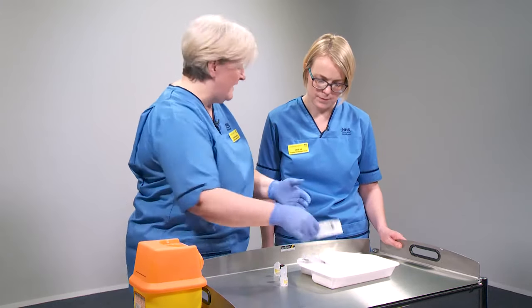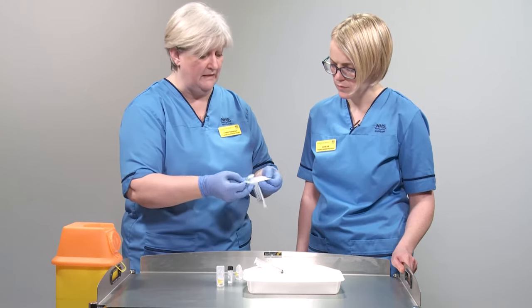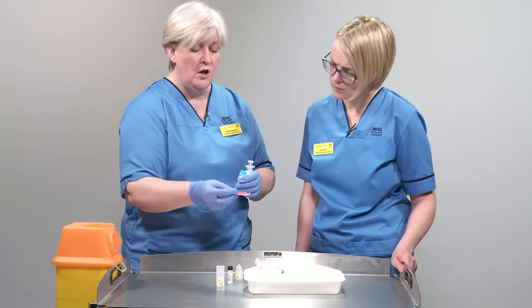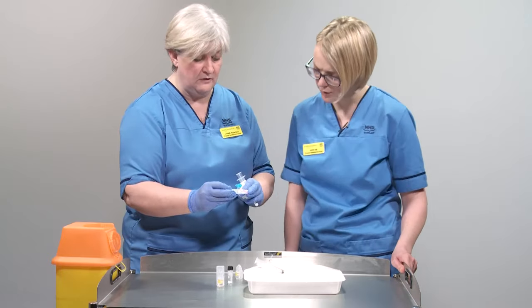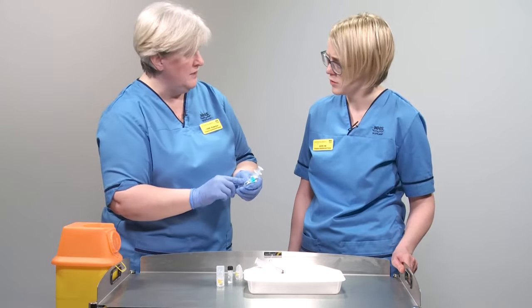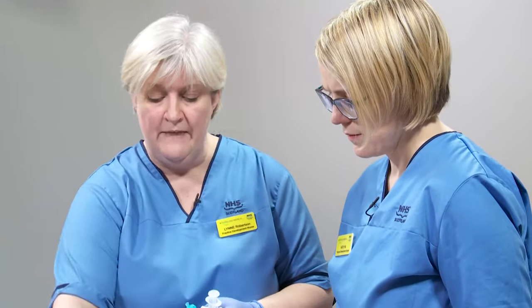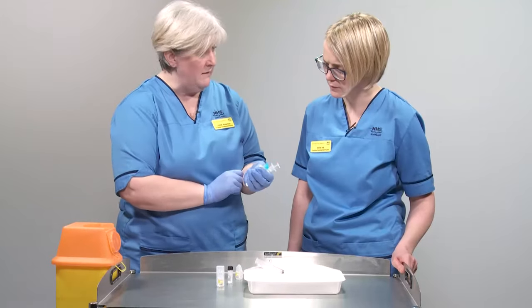Peel open the packets for the medicine syringe and needle. For a glass ampoule I could use a green hypodermic needle, but I don't want to use a white needle — it's too big and there's more risk of drawing up particulates into the medicine. Blunt filter needles are for things that are really thick and sticky; you'd draw up with a blunt filter needle and then change to a hypodermic needle. But I'm not using that in this instance.